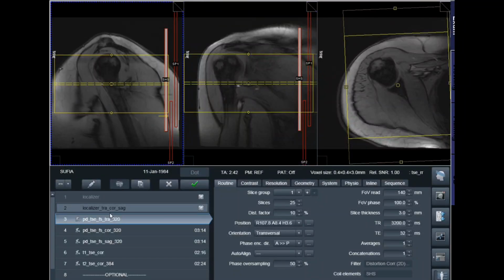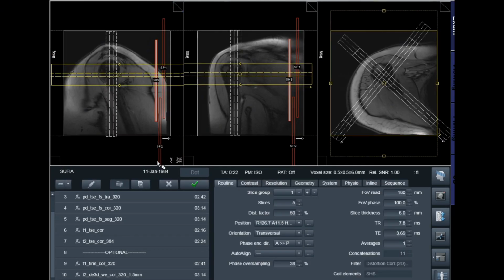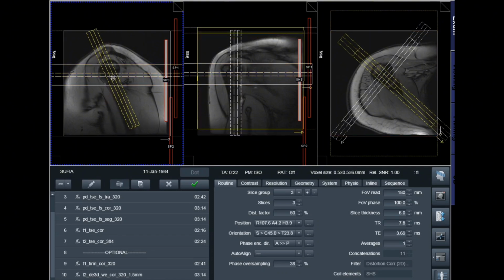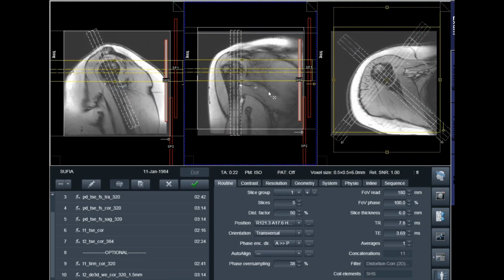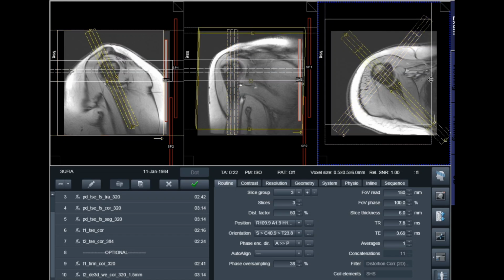In today's video, we will discuss MRI of the right shoulder joint in a clinical and academic perspective. Shoulder pain is one of the most common musculoskeletal complaints encountered in orthopedic and general practice. Due to the complex anatomy and extensive range of motion, accurate evaluation of shoulder pathology is often challenging with conventional imaging. MRI is considered the imaging modality of choice for comprehensive assessment of shoulder joint pathology.